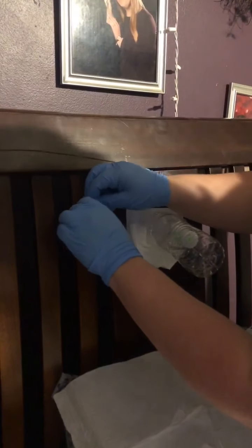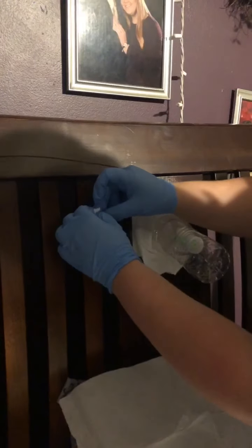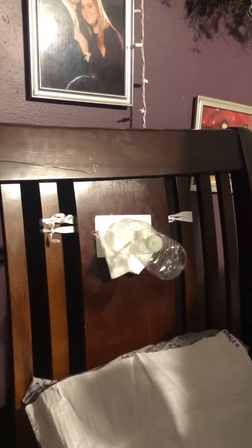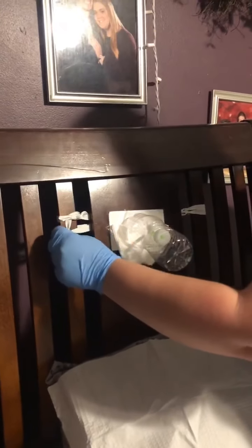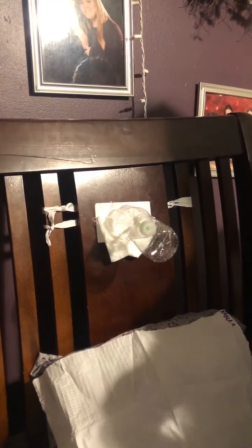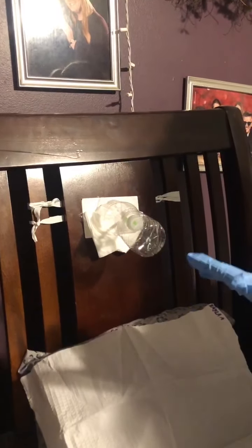And then again, I would assess to make sure my patient is comfortable and that they can move their neck freely, but it's still secured. And then I would remove the old ties following that, and my patient has his oxygen on.